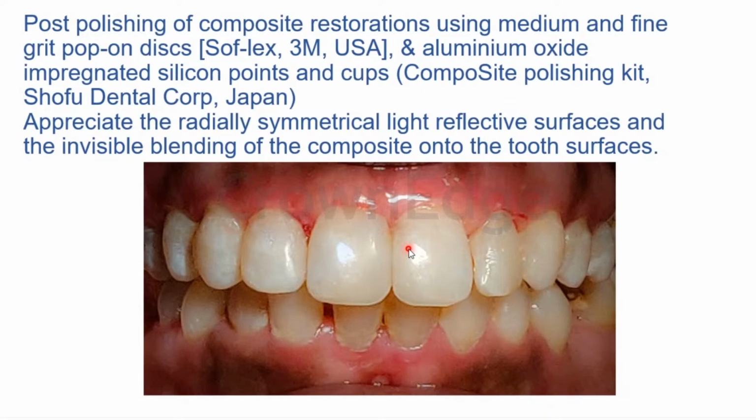If you look at, for example, the 3M Single Bond instruction manual, they tell you to use a tissue paper to wrap around the tooth surface and just dab it over there, or you can use just a cotton pellet, and the dentine should be left moist when applying the bonding agent. Especially with the fifth generation, sixth and seventh, we are looking at a moist dentine to place our bonding agents, even with the fourth.